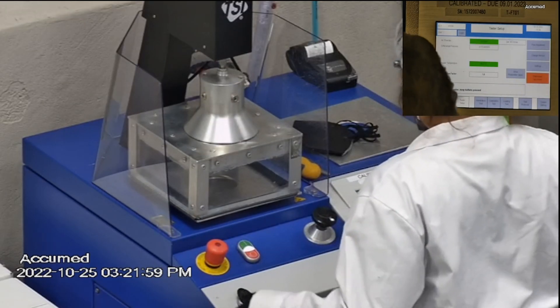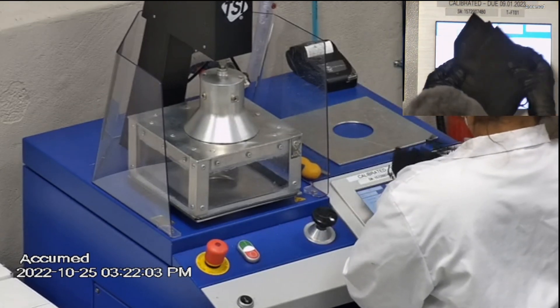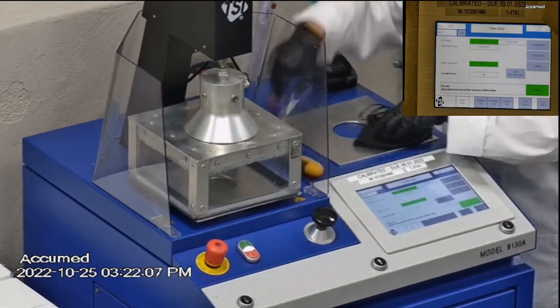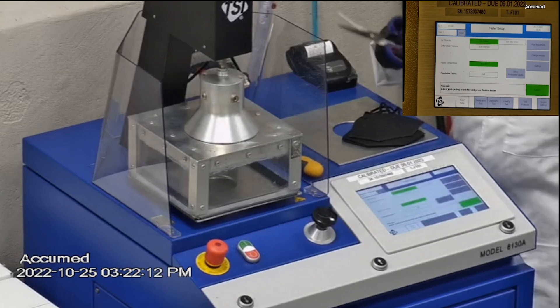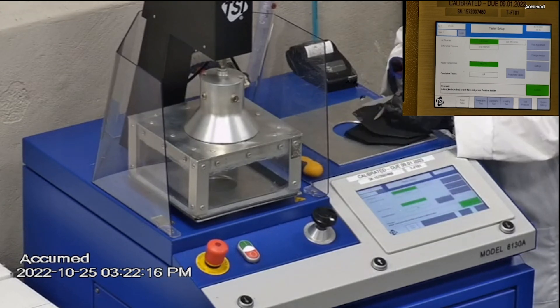Now we're gonna run them through our TSI machine. This is our TSI machine model 8130A which is also the same filtration testing machine that NIOSH uses to approve N95 respirators.